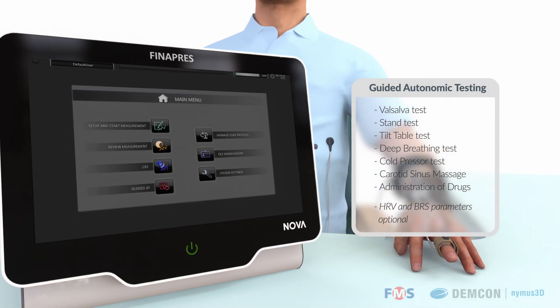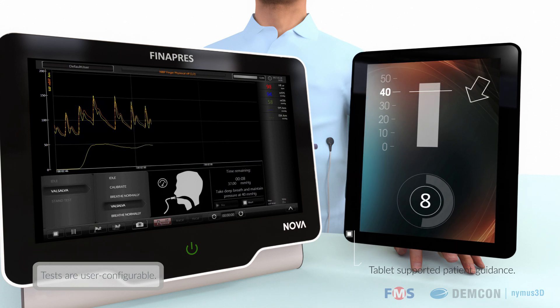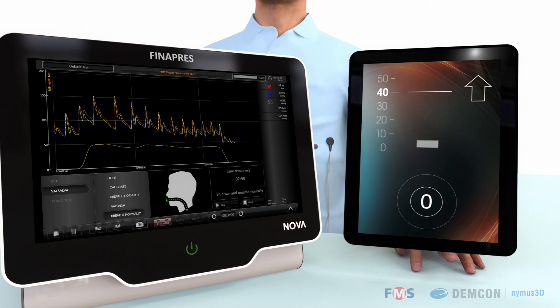The guided autonomic testing application guides the user through several tests, like the Valsalva. Such tests are used to assess the autonomic nervous system. An iPad is included to provide intuitive feedback for the patient during the tests.